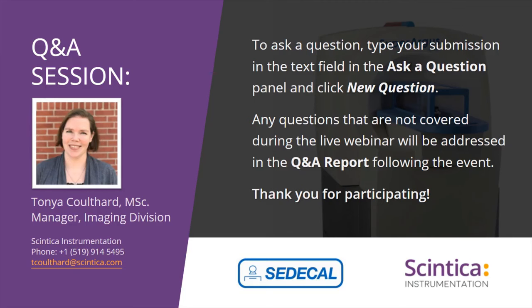One other thing to keep in mind, if you're placing the system, because there is no extra shielding required, in a room with other equipment, you do need to have a minimum distance between it and other equipment. This is on the order of 1 meter. If there are other PET systems in the room or other radio tracers in the room, you do want to set up some type of shielding to prevent any stray radiation coming from those sources from entering the SuperArgus system. So just things to think about when you're configuring your room layout.